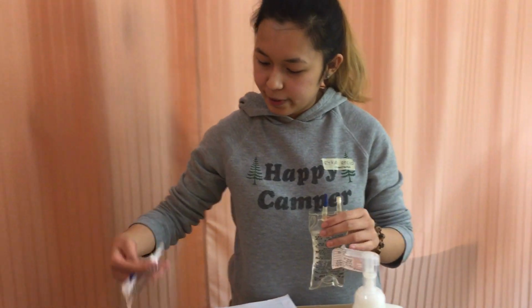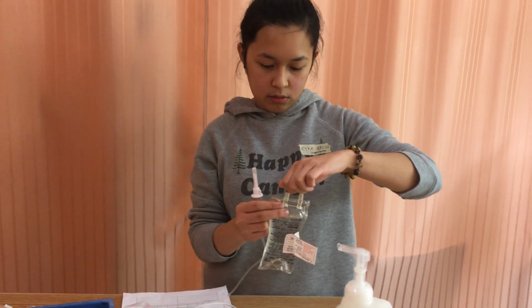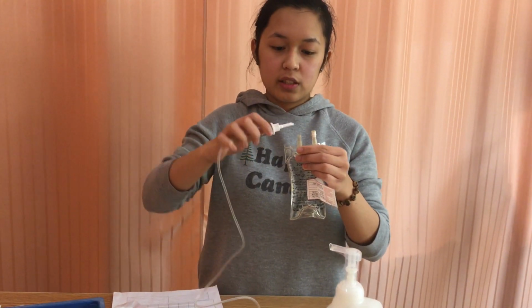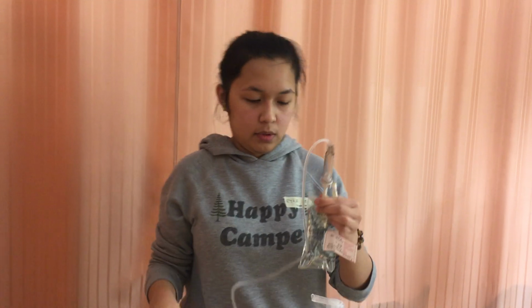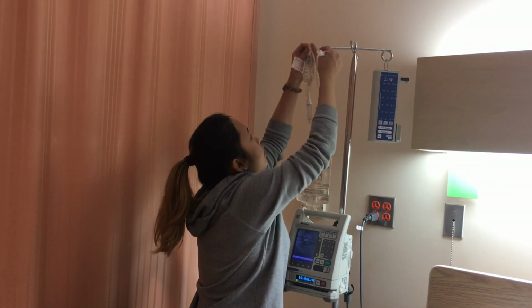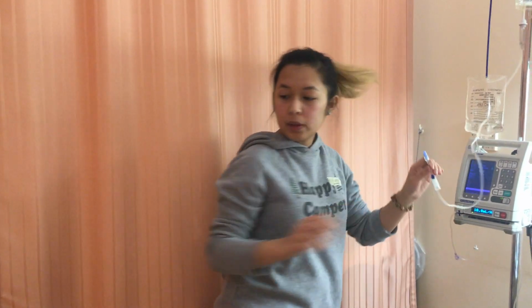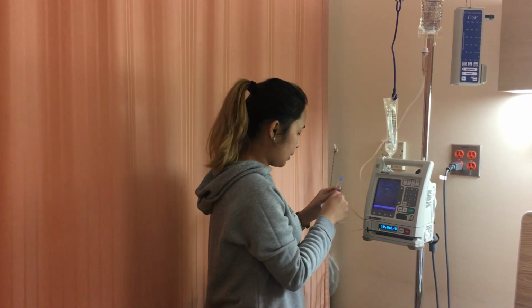Going to spike my bag. And I'm keeping making sure that these ends are sterile. Not to touch them. I'm going to connect the secondary tubing on this port before my Baxter pump because I want this medication to be regulated by the Baxter pump as well.